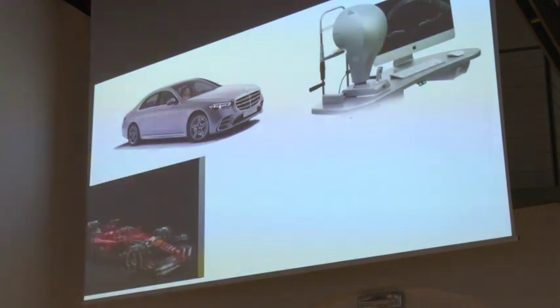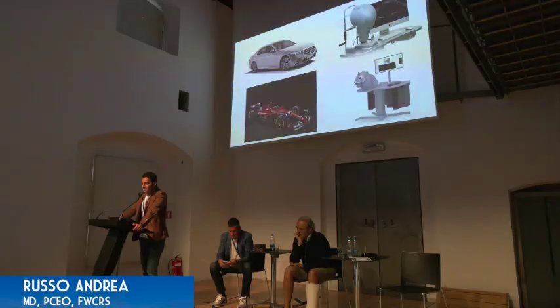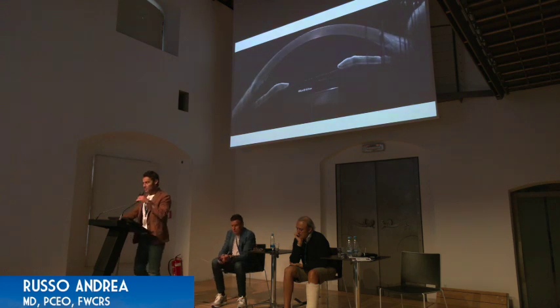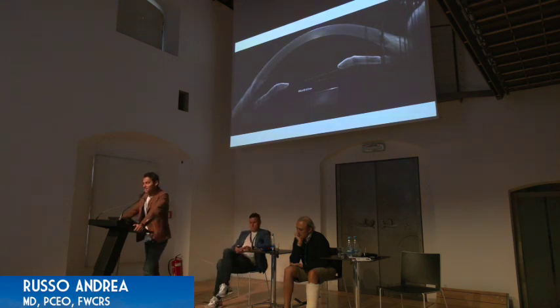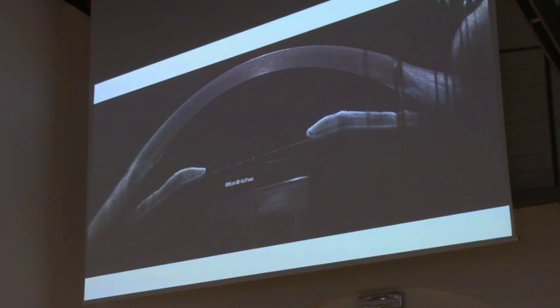Of course, probably the best solution out there is the UBM, while if we stick to the OCT, the MS-39 is by far the most convenient one. But I wanted to share with you a few nice cases of ICL seen with the MS-39. So this is the Holy Grail. This is the best sizing after the surgery, which is 500 microns.